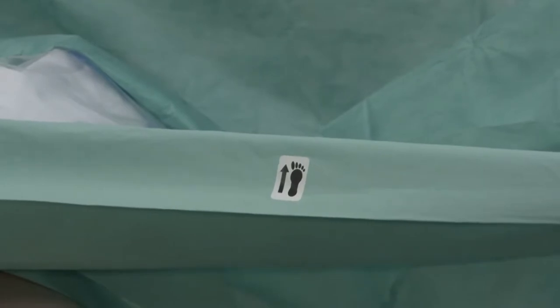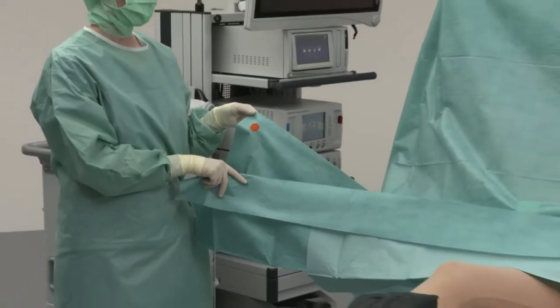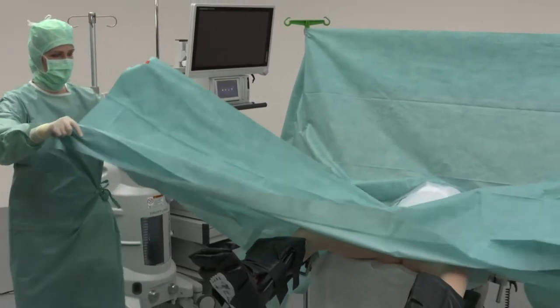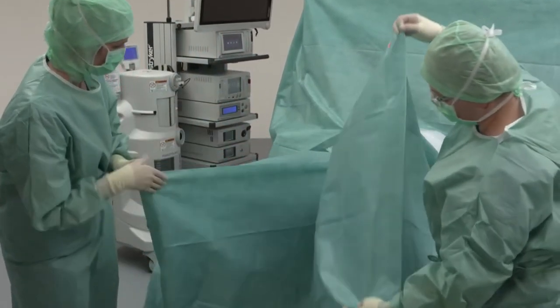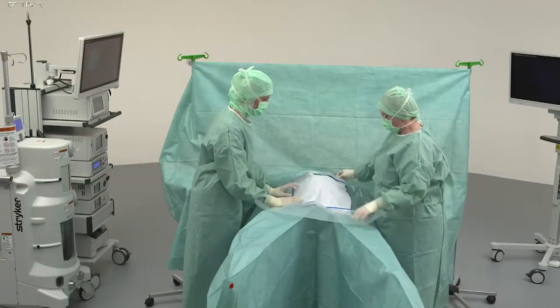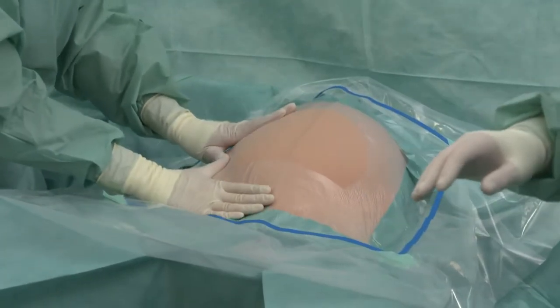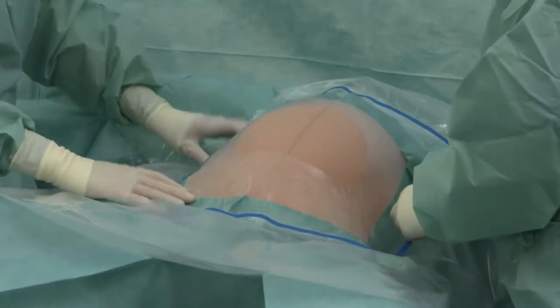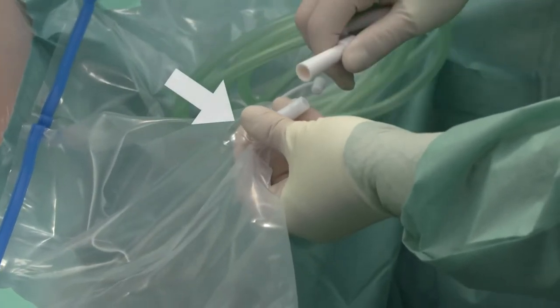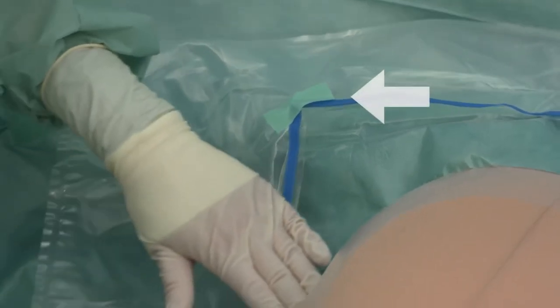The pictograms can be used to help with the subsequent unfolding of the leg drape. The red sticker marks the point where the leggings need to be put over the feet. After removing the protective paper, the elastic adhesive film is shaped. The fluid collection pouch with the integrated drainage port and the edge protection can then be draped.